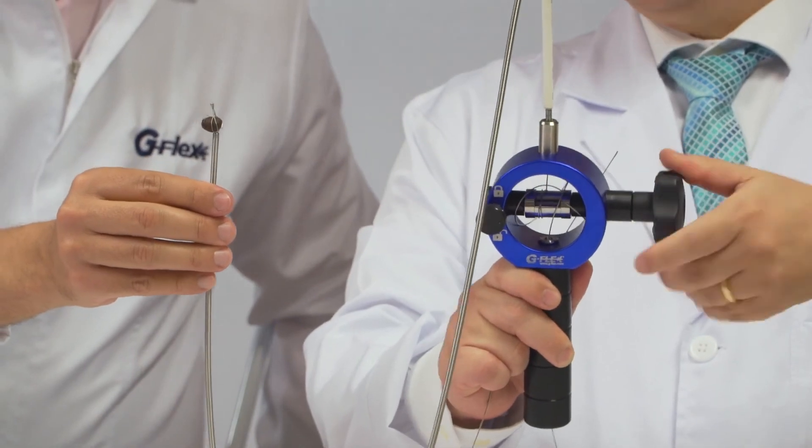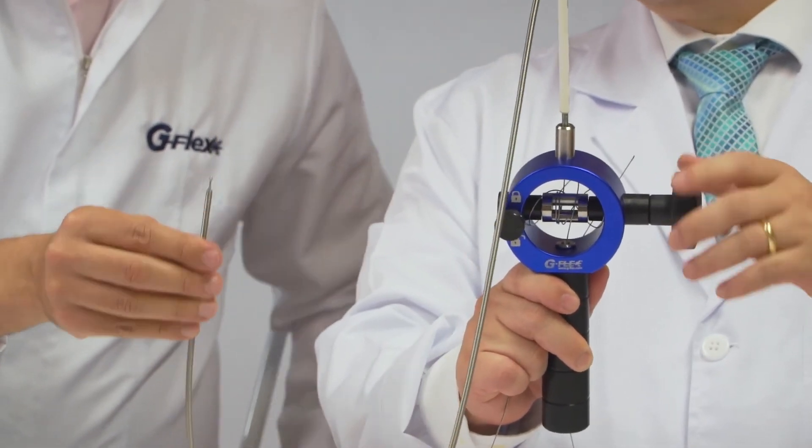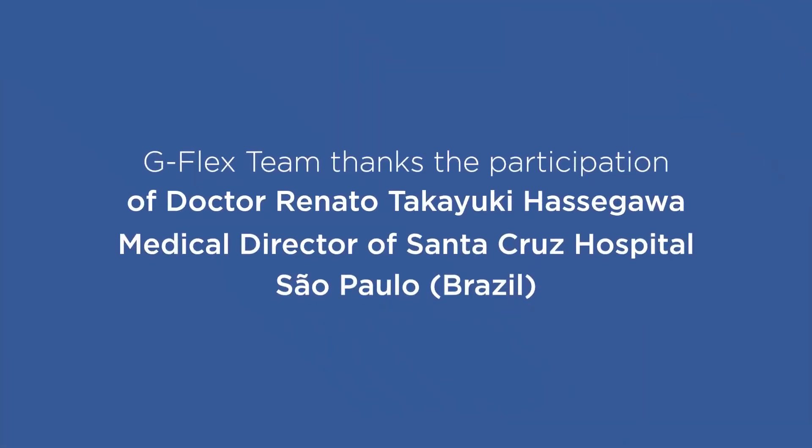As you can see, the calculus was crushed and the patient is saved.